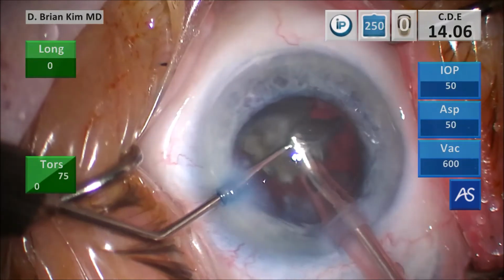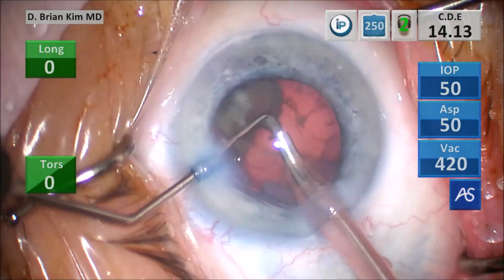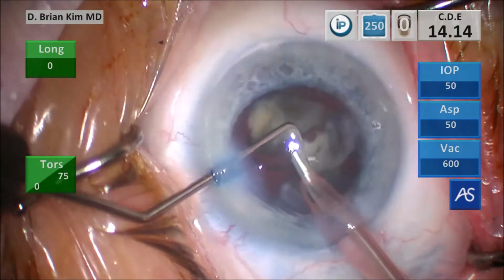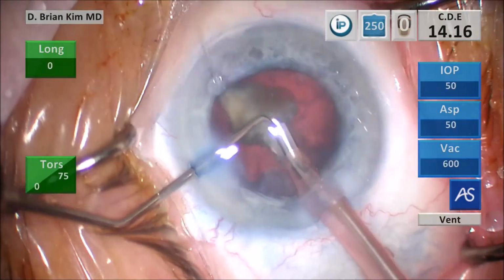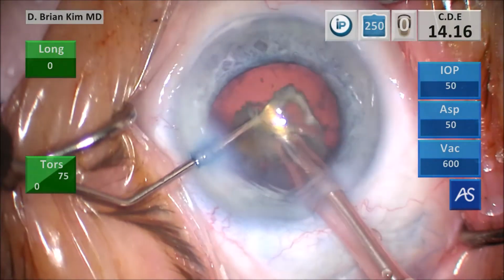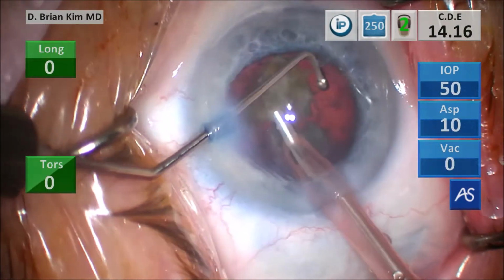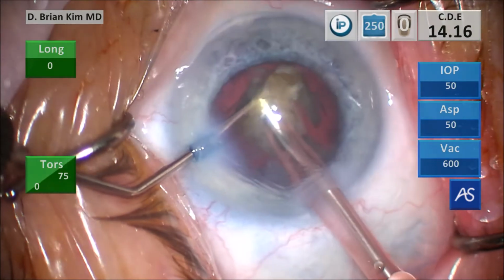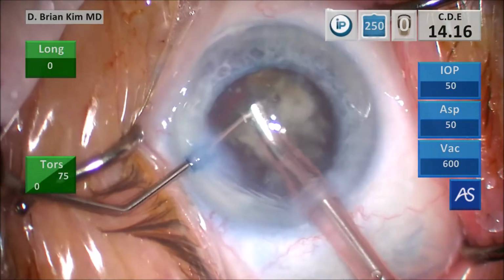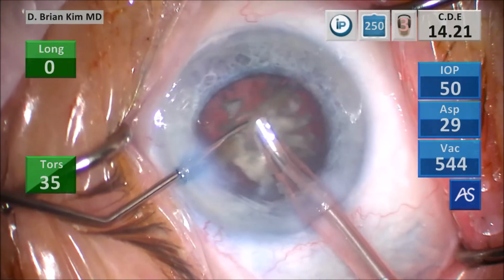Now, oftentimes with these cases, there's no epinucleus, as you can see here, and there's hardly any cortex. So it's very, very important to protect the posterior capsule because it can come forward. And so you can see mechanical fracturing really shines when you have these last pieces. Again, without using any ultrasonic energy or vacuum, just with irrigation, you can just position the instruments around the lens pieces and crush it over and over and over again.